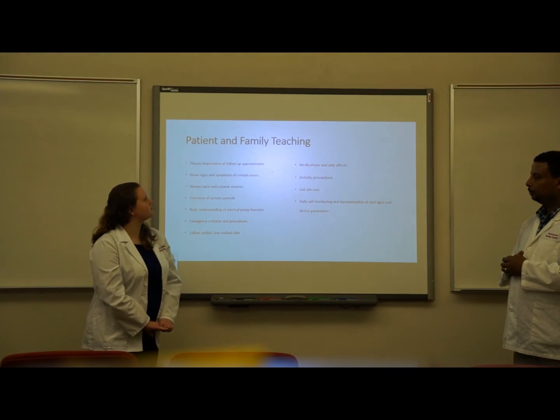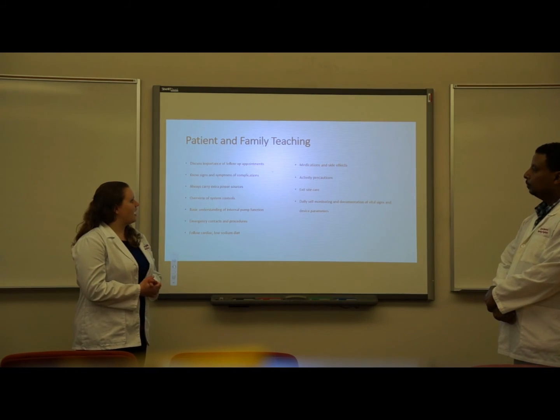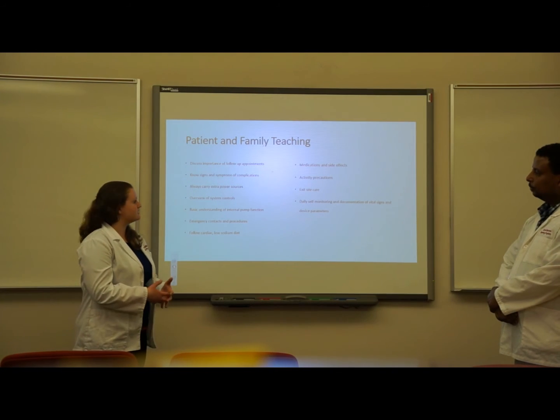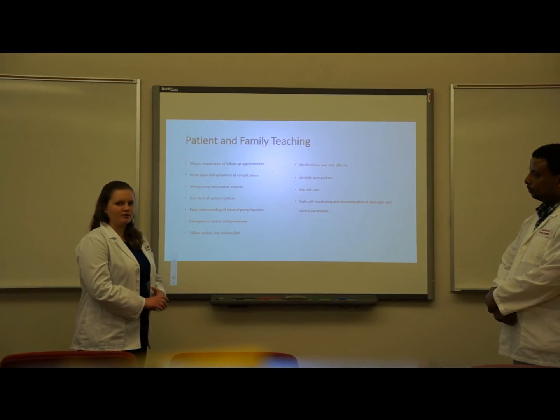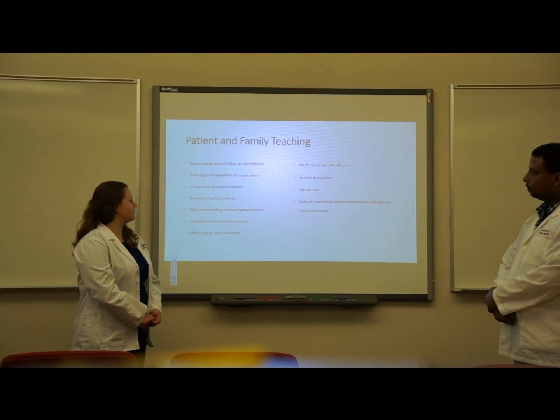Okay, so now we're going to talk about patient and family teaching. You want to discuss the importance of follow-up visits so that the status of the patient's Lvad and status of the patient's health can be assessed at those visits. You want to have the patient know the signs and symptoms of complications. They should always know to carry an extra battery, an extra power source, an extra control device in case they need it while they're out.